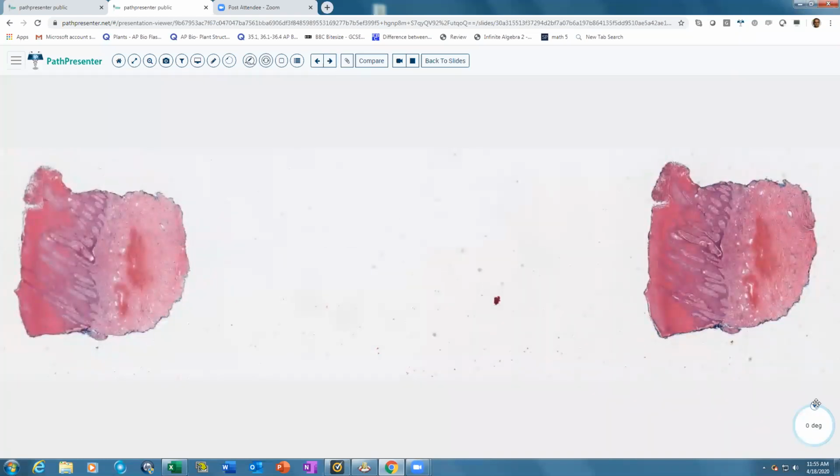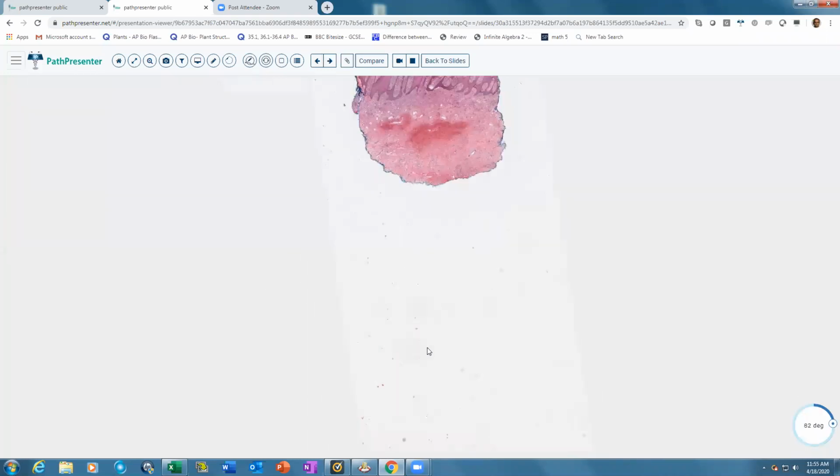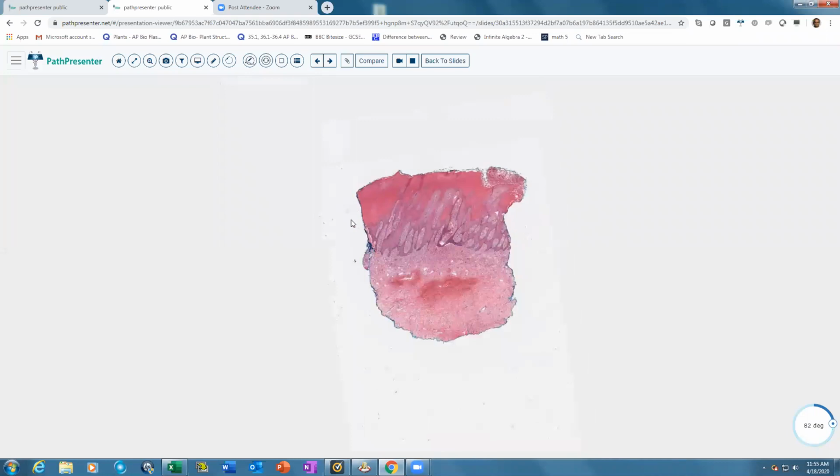One interesting variant that you can easily make a diagnosis on low power is verruciform xanthoma. It's easy to make the diagnosis on low power because this characteristically presents with this very eosinophilic, reddish-looking, almost like a fire stratum corneum. So when you see this in low power, it's very easy to think of verruciform xanthoma.